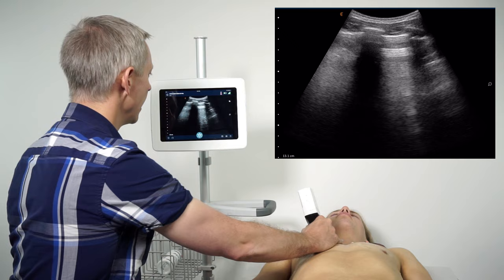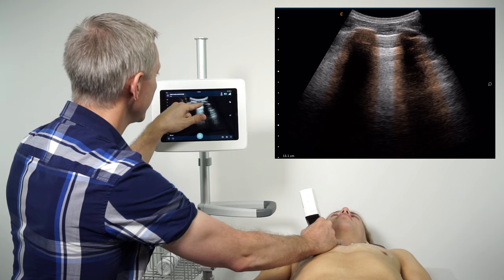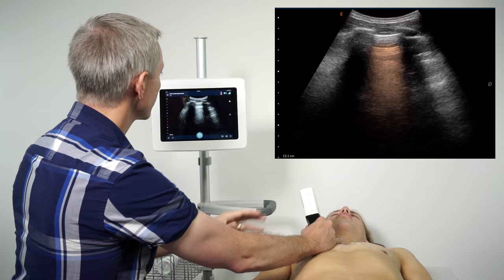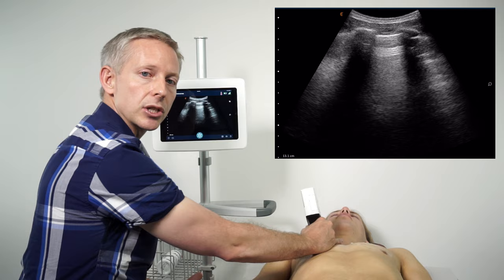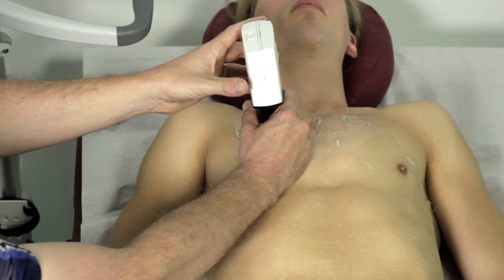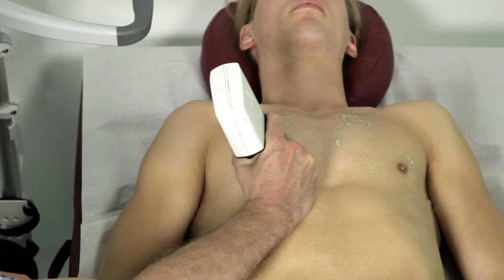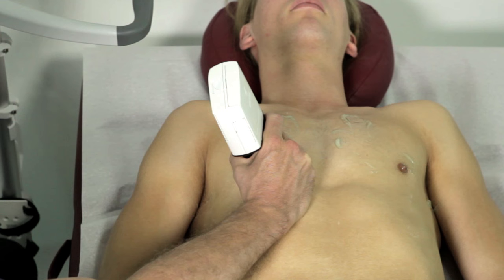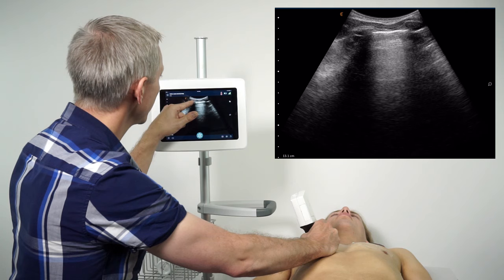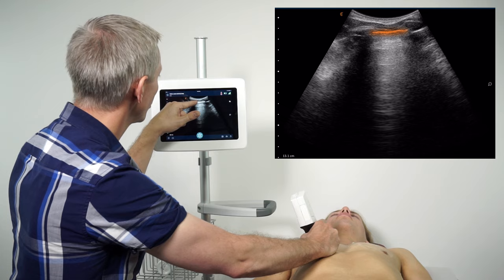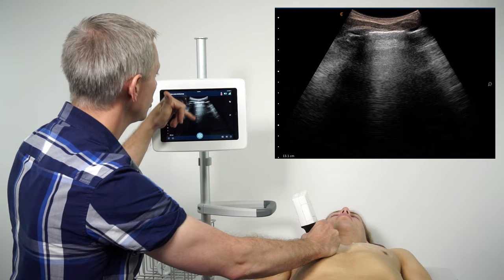Placing the rib shadows on either side, I'm looking to confirm there is lung sliding and A-lines present. In this lung zone, I can say there is no pneumothorax and nothing within the interstitium of the lung — such as pneumonia or pulmonary edema — when I see this pattern. I'll slide my transducer down to the inferior lung zone, adjusting the beam angle to be as perpendicular as possible to the pleural line. I see a beautiful bright, clean, crisp pleural line with regular repeating horizontal artifacts, confirming a nice soft tissue-air interface with nothing within the lung parenchyma.